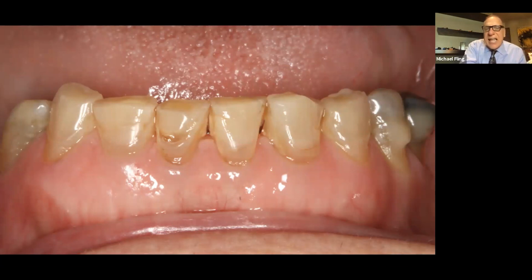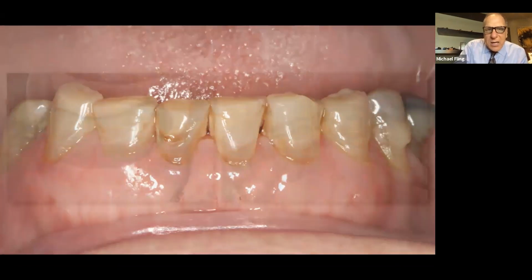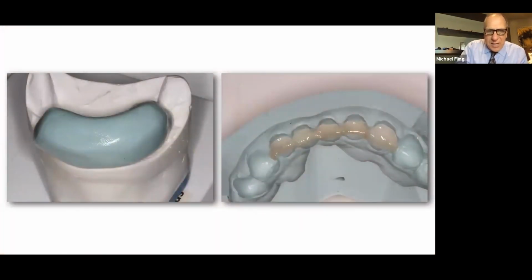So this is a case that I did with one of my residents. This was his first time to do the technique. So I want to show you that it can really be done quite easily. He did a wax up. Here was the stent that he made. And here you see the shell that was done. And I honestly don't remember if he used Luxa Crown or if we used flowable. I don't remember. It was one of the two.